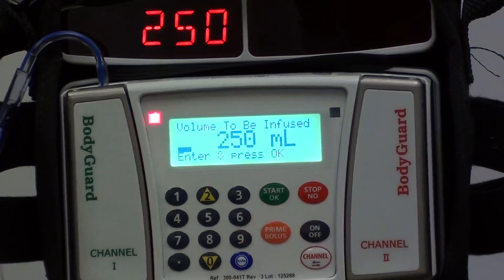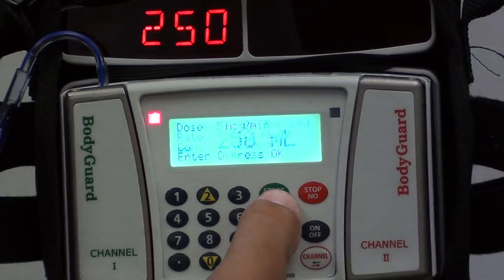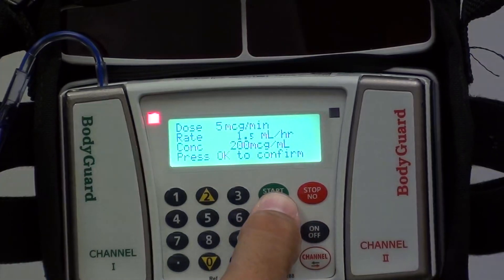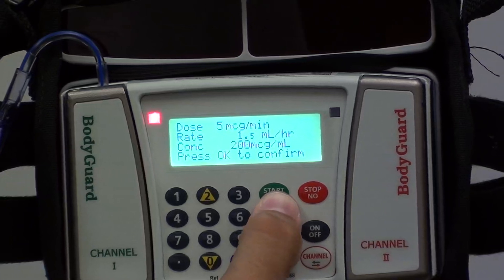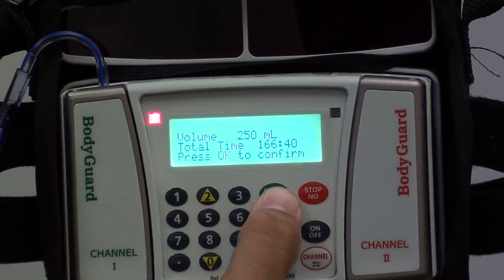It's going to then ask you what your volume to be infused is, which in this case is 250 mLs. Press OK again, and then confirm your dose, your rate, your concentration, and your volume to be infused.